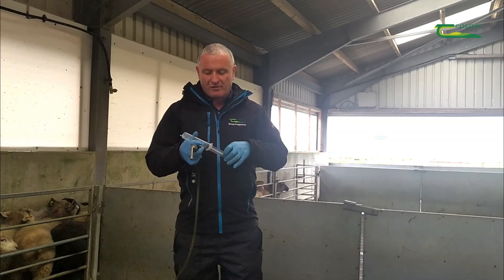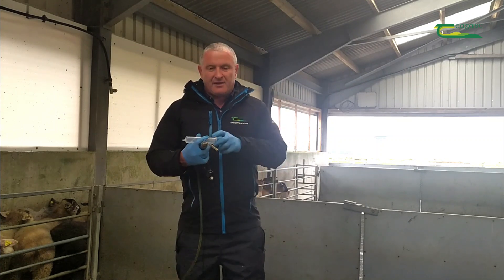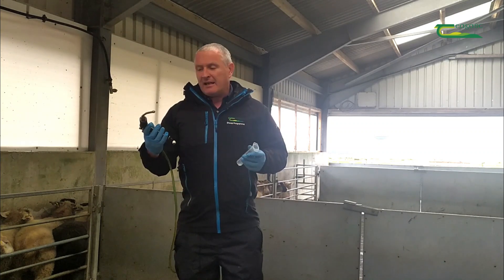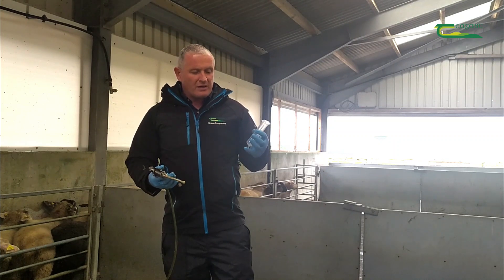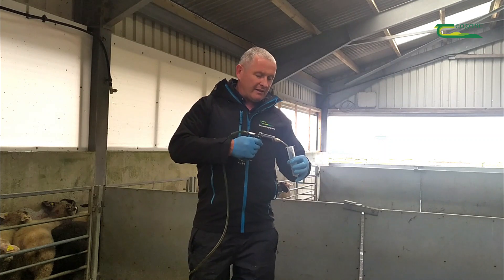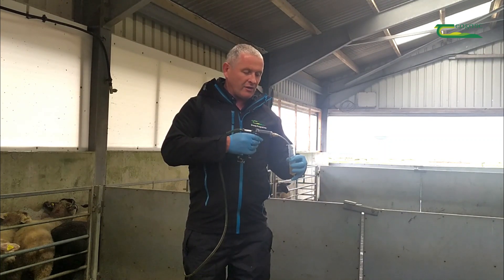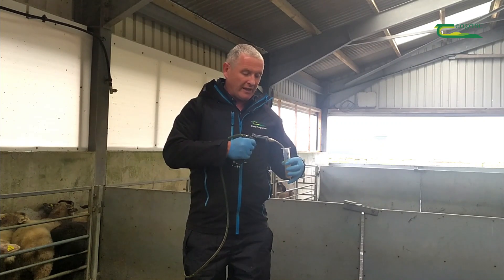By simply removing the plunger from this syringe, I'll be able to measure. The particular recommendation for this product is that each lamb gets 10 ml per head, so I've set my drenching gun to 10 ml. I'll put a number of doses into this graduated cylinder. It's important to remember that you depress and release the gun fully each time.